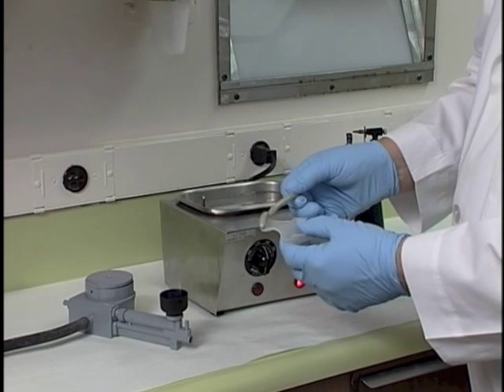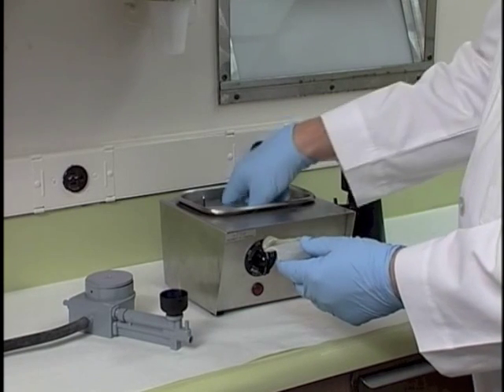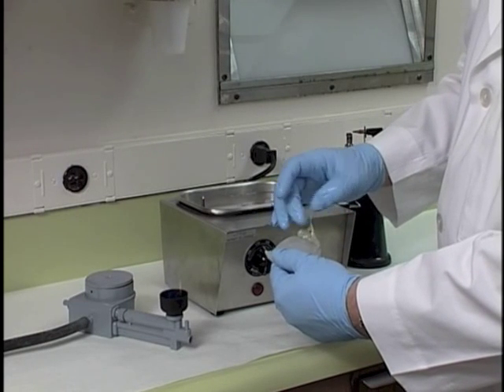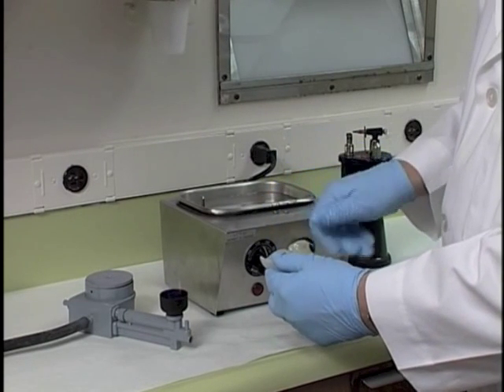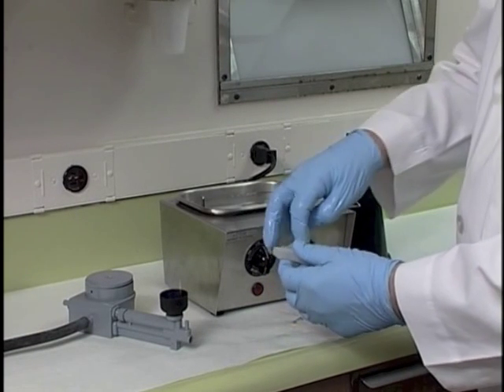Then we apply that softened material to one section of the tray. I usually do that one section of the tray from a hamular notch area all the way up to about the buccal frenum area.